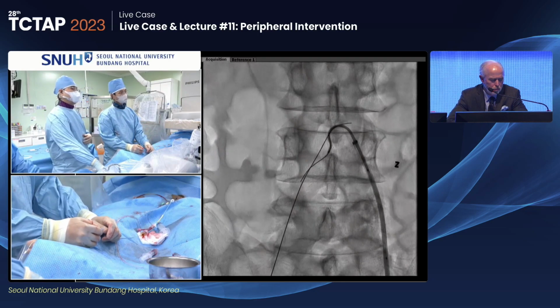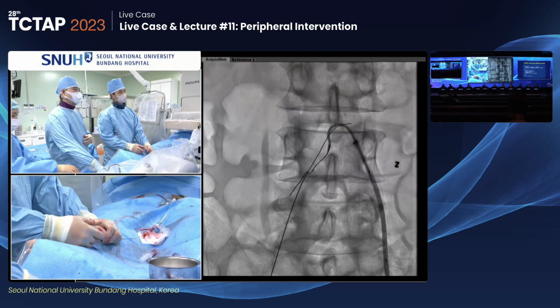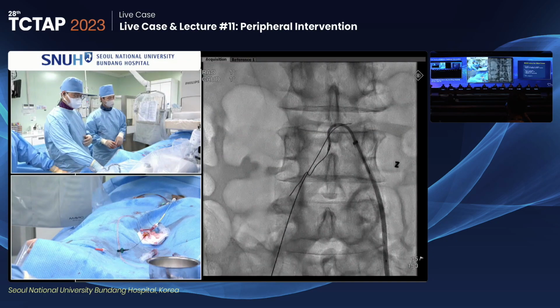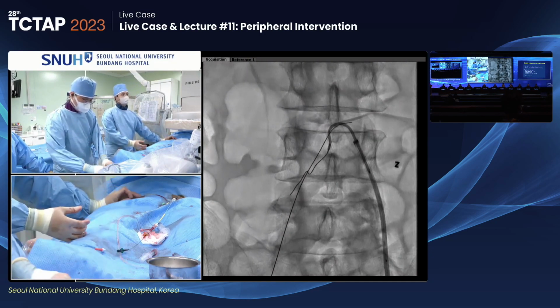Did that have any more resistance going in this time as opposed to the previous? Yes. There is also resistance here at this moment. I think it loops in this area. And I navigate the proximal, the retrograde wire here. It doesn't look like it's interacting.